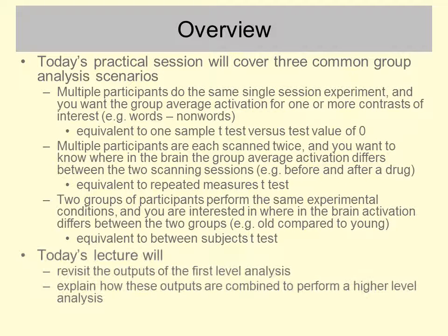So in the lecture today we will remind ourselves of the outputs of the first level analysis, because these outputs are what form the inputs to the second level analysis. And we'll just see how those are combined in performing the second level analysis and what the different options are.